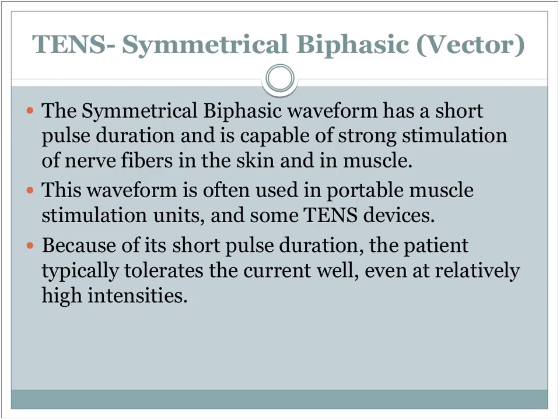So I go through that long explanation because you can't put TENS on and expect pain to go away, okay? We're not blocking pain. What we're doing is reducing it because now the nerve fibers that normally carry the sensation of pain can't work as effectively, okay?